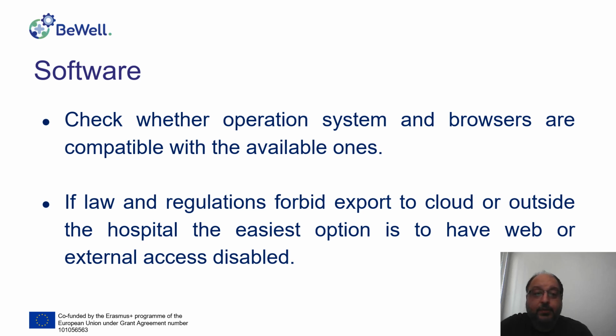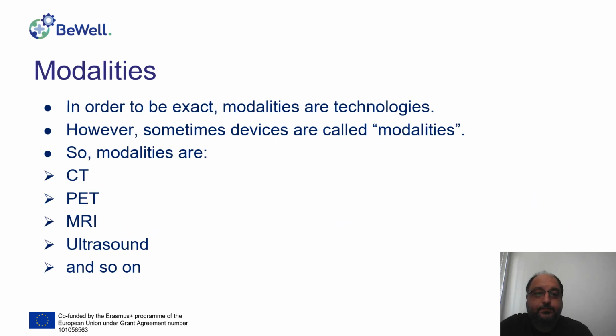For example, if you live in a country in which regulations forbid exporting the patient's data outside the hospital or to the cloud, there is an option to disable the web access, the external export, or whatever.